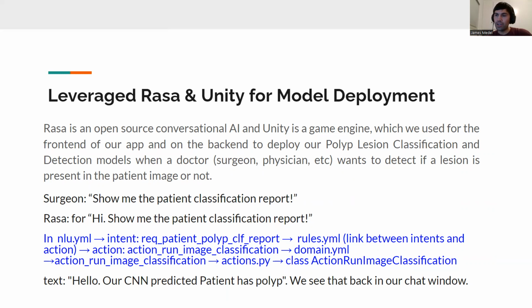The other part was to display the text and the images. We wanted to display it in a nice graphic user interface, but also eventually to the point where we can do simulation with it. And so we chose Unity, since Unity would offer a nice transition eventually from 2D to 3D.